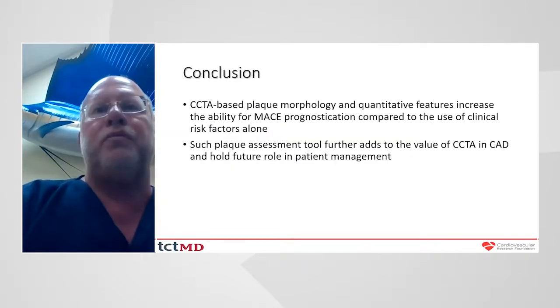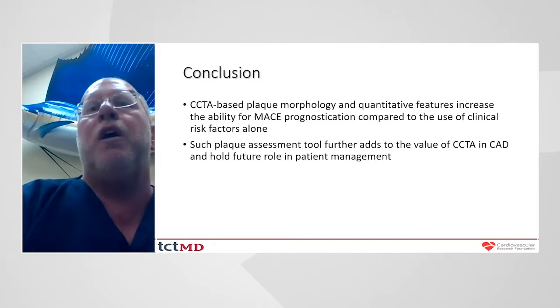In conclusion, I think CTA-based plaque morphology and quantitative features increase the ability for MACE prognostication compared to the use of clinical risk factors alone. A plaque assessment tool such as ElucidVivo further adds to the value of coronary CTA in CAD management and holds a very promising future role in patient management to identify patients who need our help right now and in future.